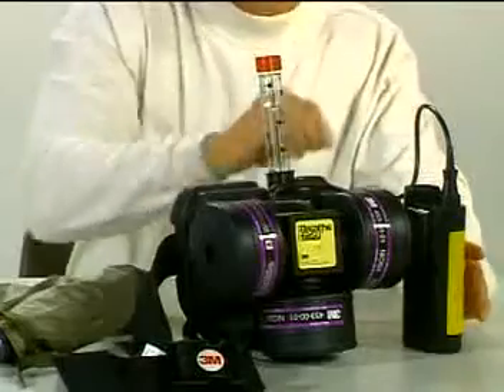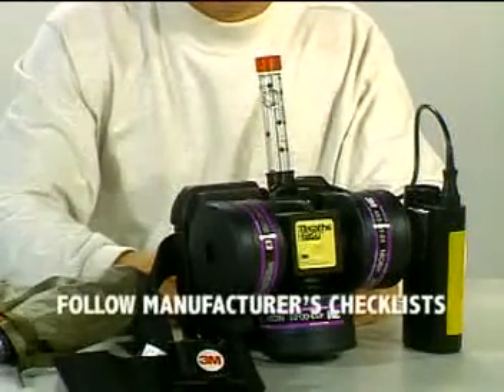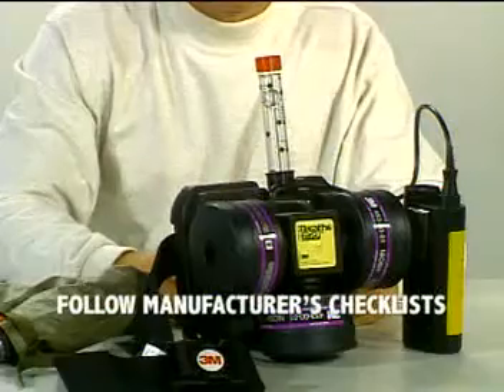PAPRs should not be used until all pre-operational checks are performed in accordance with the manufacturer's instructions. PAPRs require the wearer to be medically cleared, especially for conditions associated with increased airway resistance. CSEP also requires appropriate training before personnel can wear a PAPR.